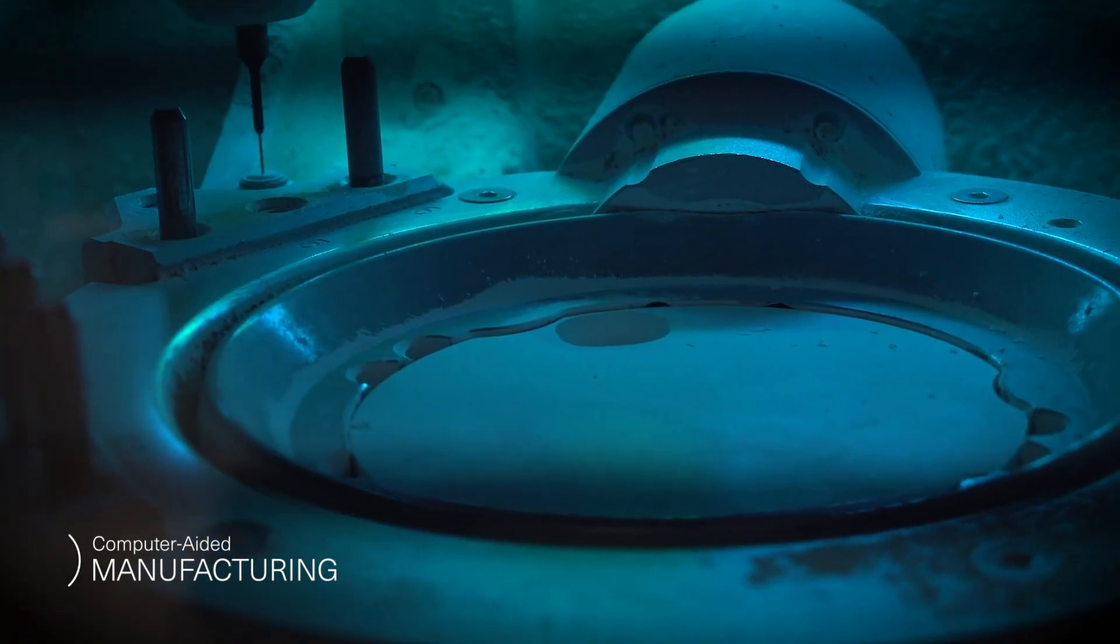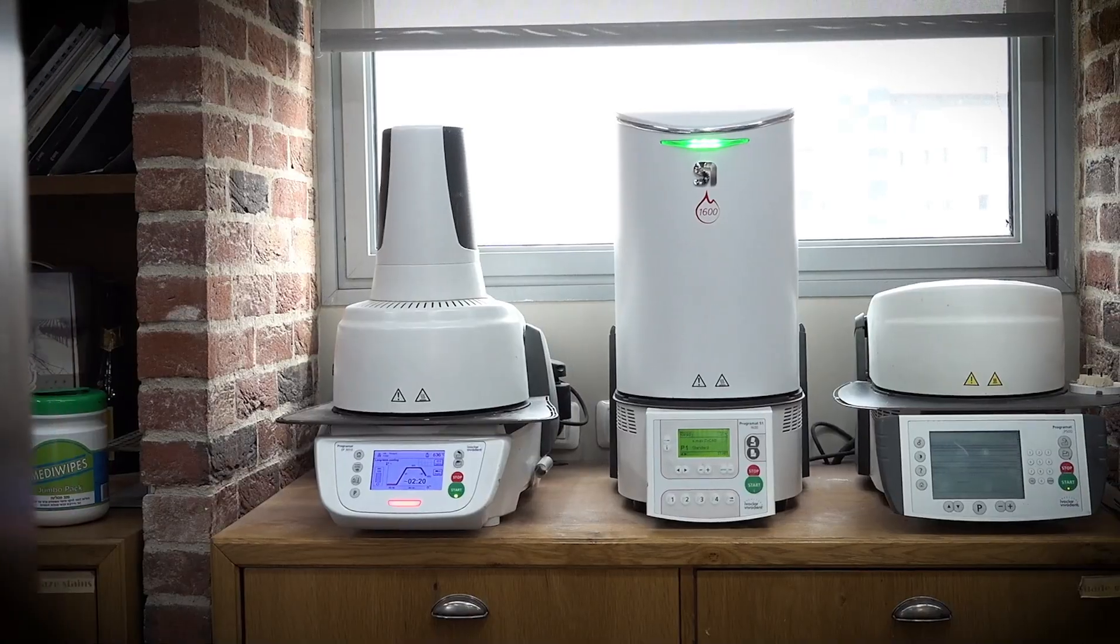Export the digital file of the crown to the milling machine. After the milling, the crown will go through a sintering and glazing process.